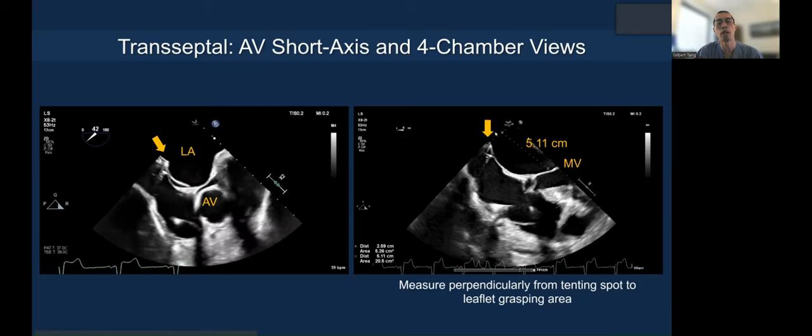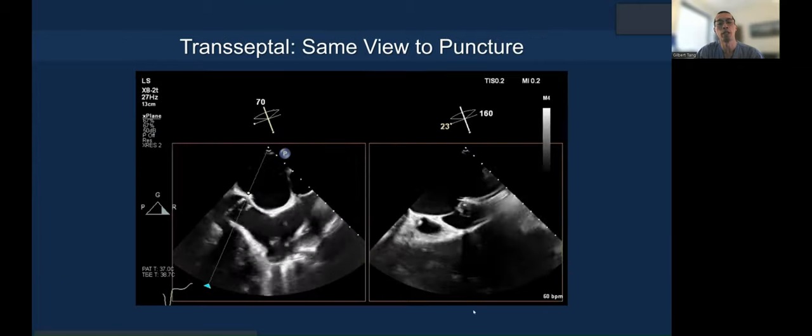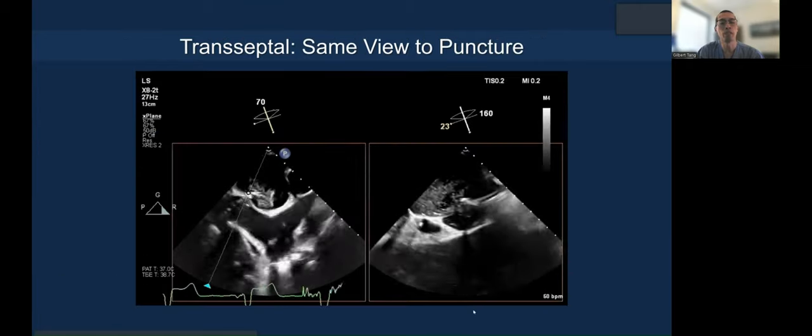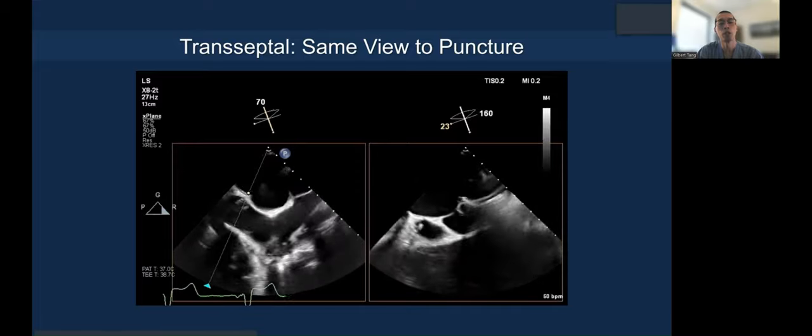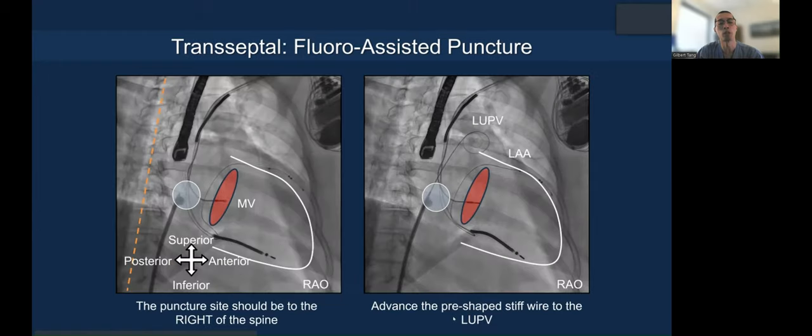Here's the same view showing the puncture occurring in two imaging planes — superior–inferior and anterior–posterior. The fluoroscopic projection is also important: I've superimposed the tenting area with the fossa illustrated, and you can see the mitral annulus roughly here because you can see the coronary sinus lead.